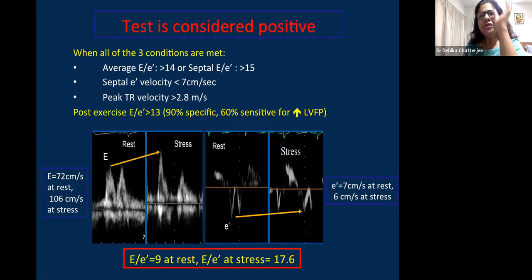These are the patients who are fit for the diastolic stress test, and that will reveal the cause of their shortness of breath with this test, and we can label this group of patients as early HFpEF.